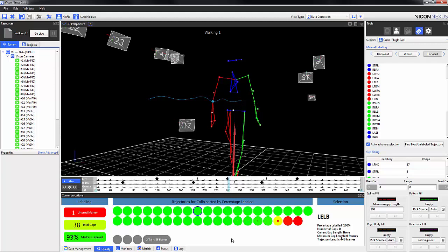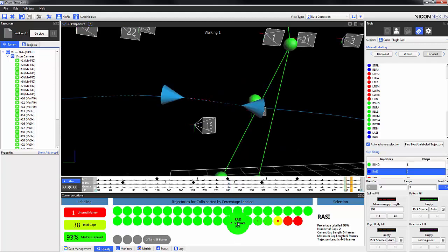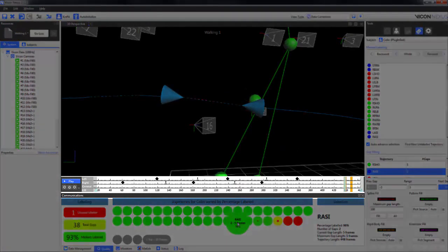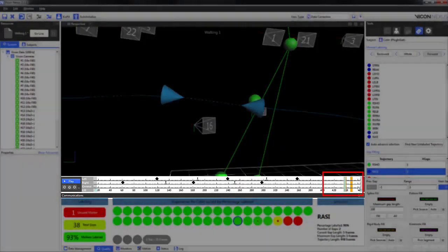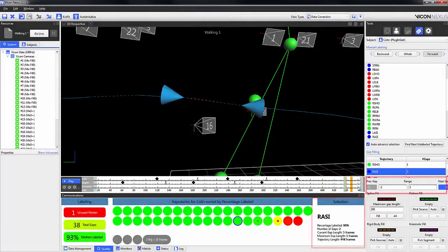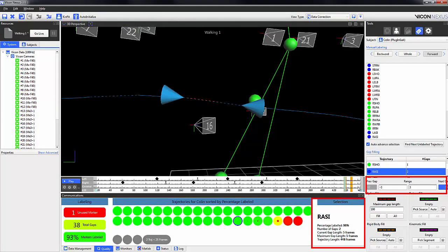Selecting a trajectory will take you to the middle of the first gap. On the time bar, you can see the vertical orange bands. These bands indicate the frame range where the marker is missing.